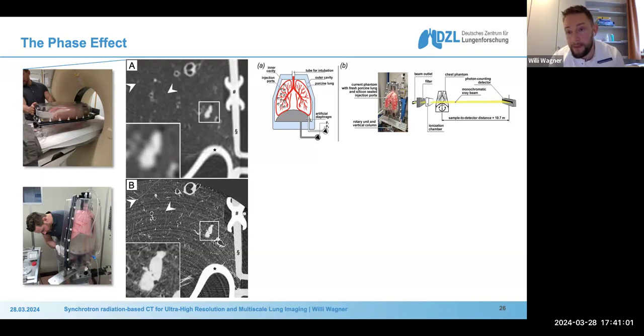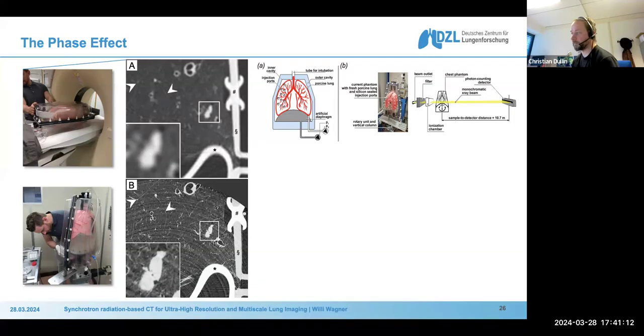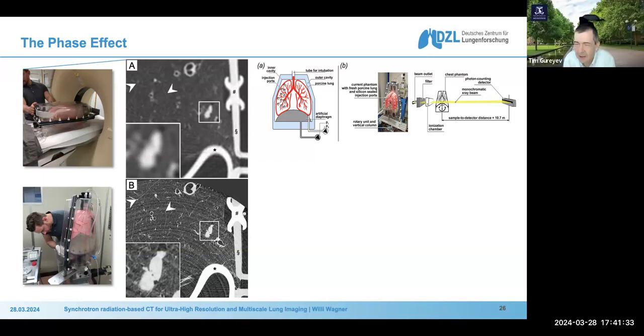Yeah, and there's another issue that till now we use very simple filtered back projection reconstruction. So there is nothing optimized, no iterative reconstruction, nothing. And we used a lot of projections because we had the problem that the detector was fast, but not the rotator that we had. So we had actually more projections than necessary. So I think we have still a lot of options to get the dose even lower. Excellent. Thank you.